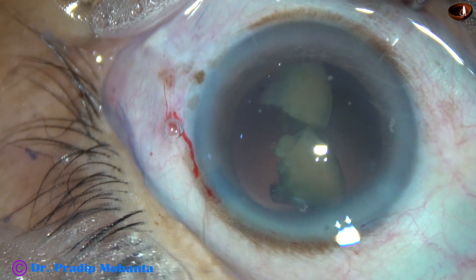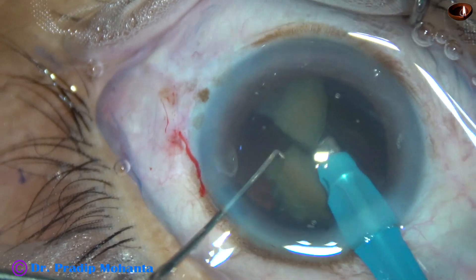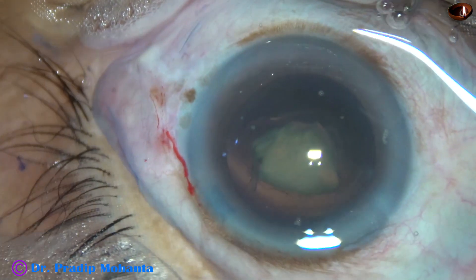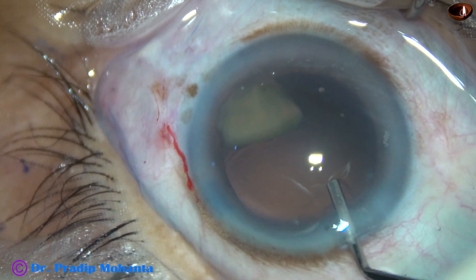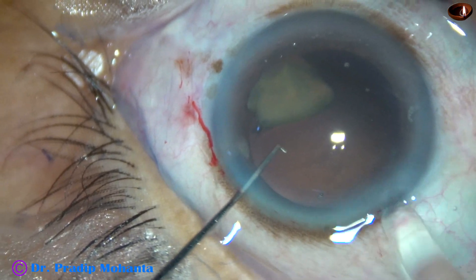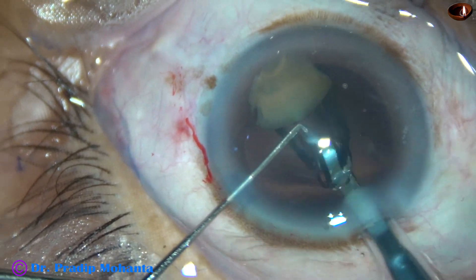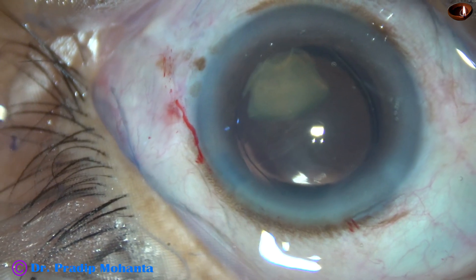And now I go again to emulsify this piece. I then place the intraocular lens in the capsular bag. Yes, both the haptics have gone into the capsular bag.